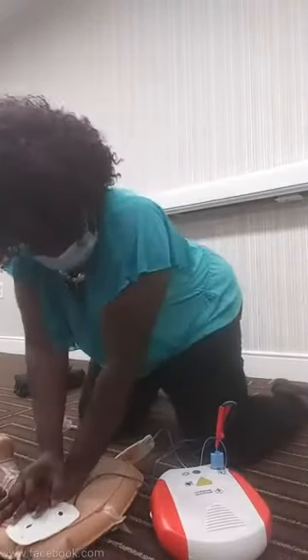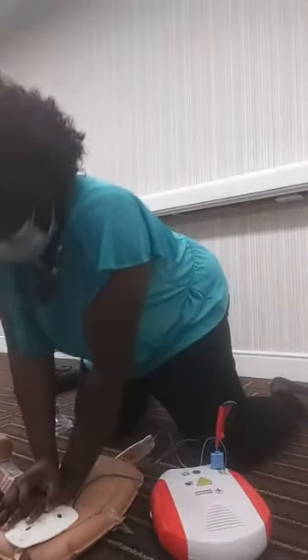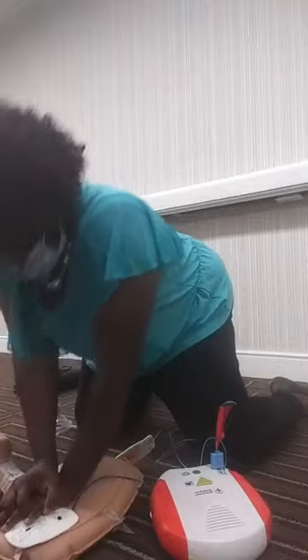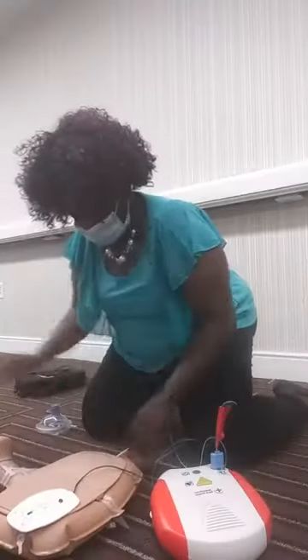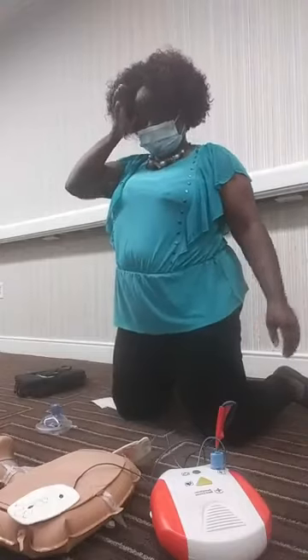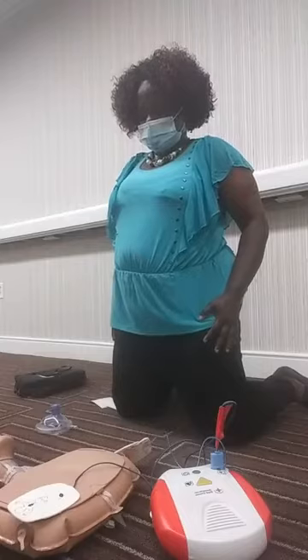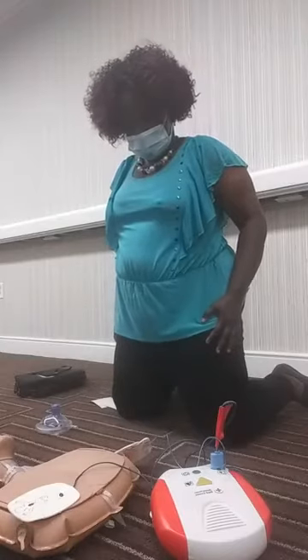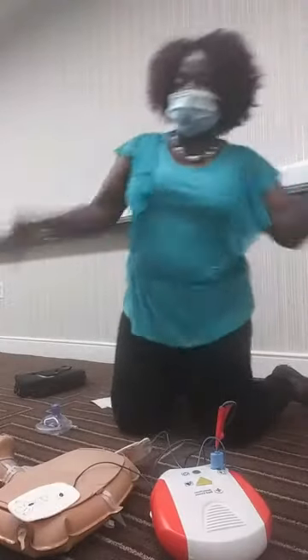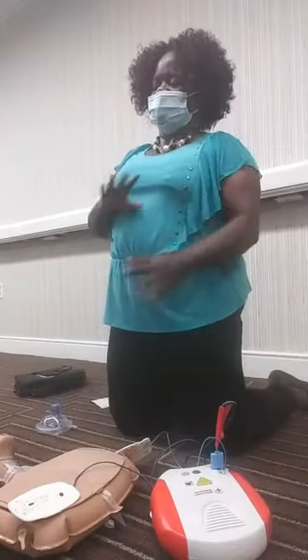The AED is getting ready to reanalyze. It will say: analyzing rhythm, stop, all clear. Sometimes it will say 'no shock advised, begin five cycles of CPR' and you resume compressions. Other times it will say 'shock advised' and you proceed with the shock protocol.